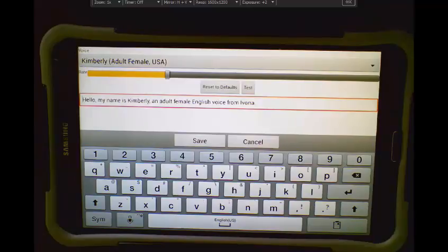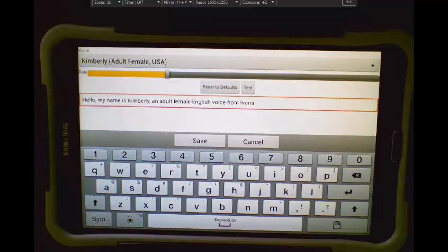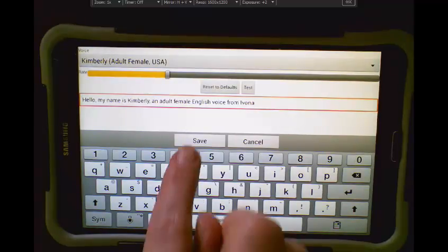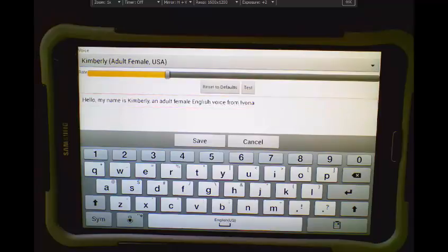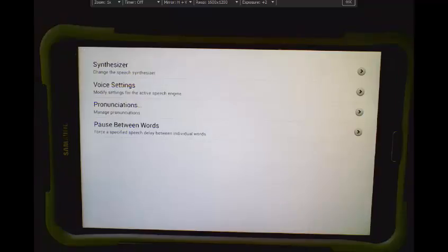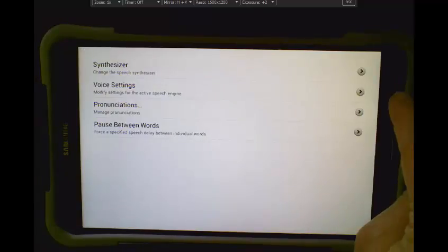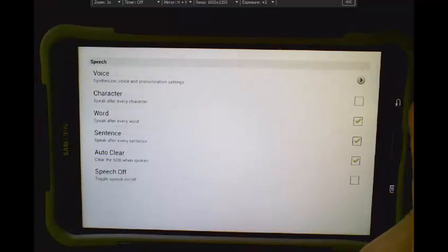Hello, my name is Kimberly, an adult female English voice from Ivona. Once I've adjusted the voice, I need to tap Save to save that setting, and I can go back to my vocabulary from here.